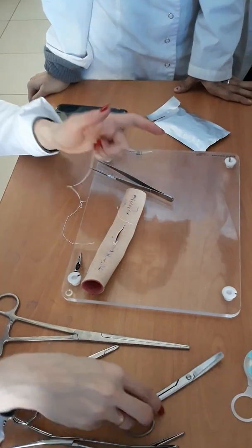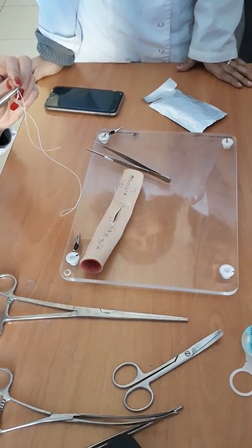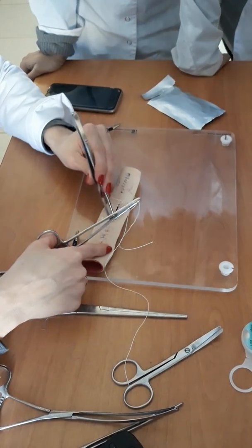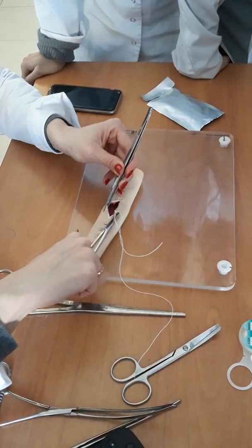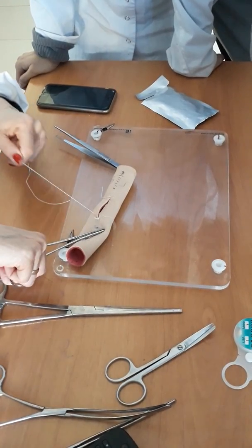Okay? After that, I will demonstrate continuous suturing. Continuous also penetrate suture. What should you do? You should grab, I continue, okay? Also 5 millimeters. Here, also 5 millimeters. Make first a knot.